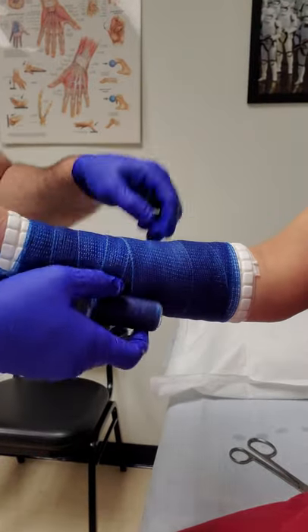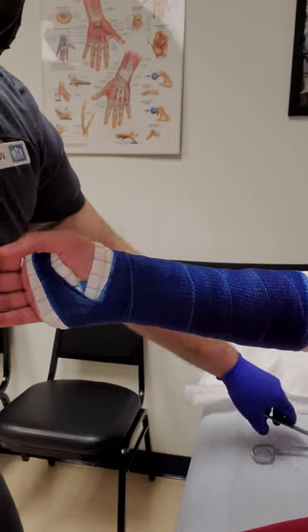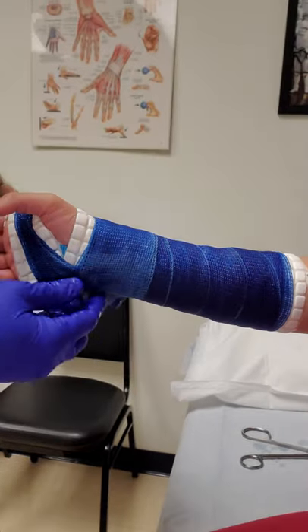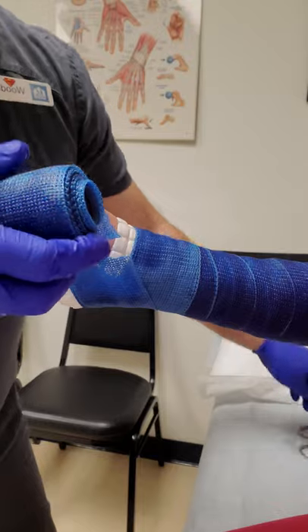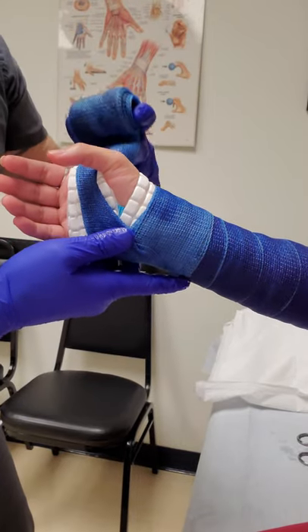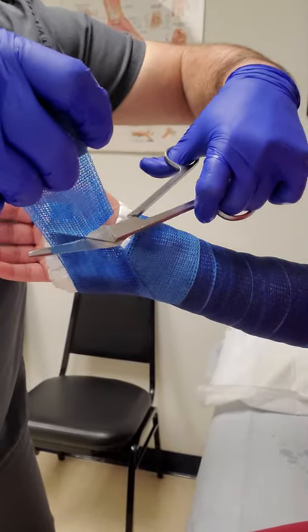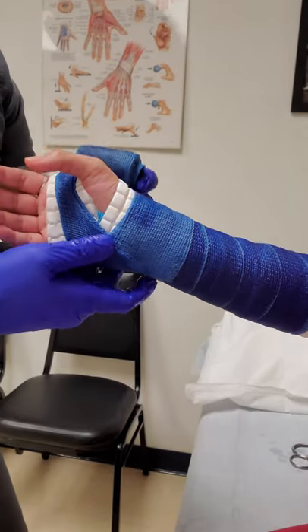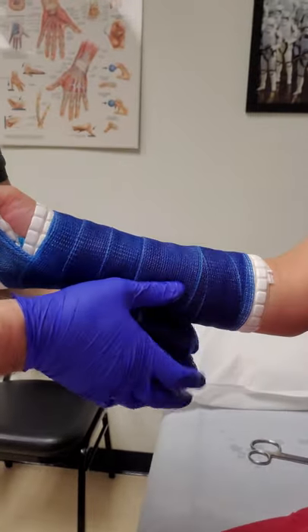This is the first layer, and since this is an adult-size arm, we'll go ahead and do two rolls of fiberglass to make it nice and sturdy. This will be the end of part one of the video. Part two, immediately after this one, will cover how to remove the cast properly and different tricks regarding the cast saw on Gore-Tex versus cotton. If the removal part is more important to you, you can skip right to that one. I'll see you on part two.